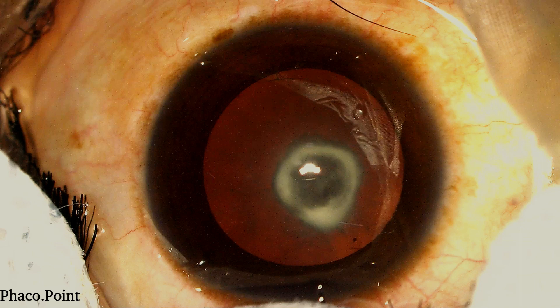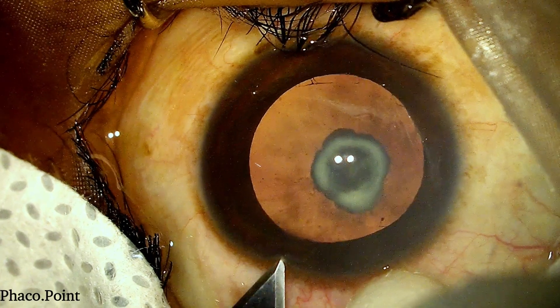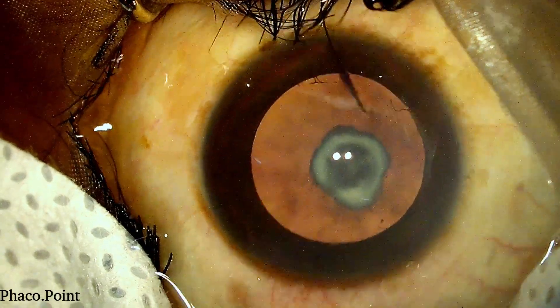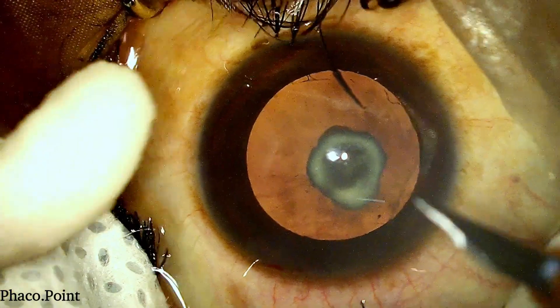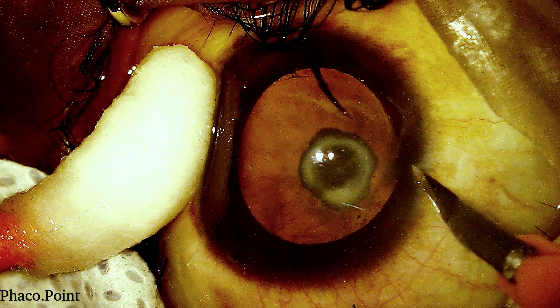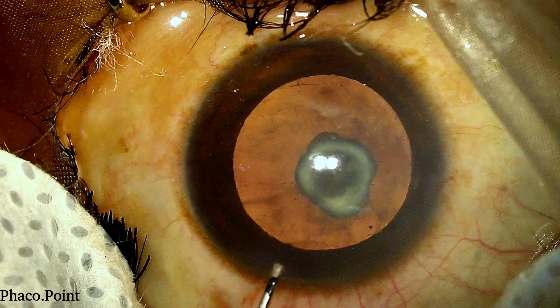This is the patient with a classic posterior polar cataract. After installing a few drops of paracaine prior to this step, we start with making the incisions as well as creating both the paracentesis incisions. We must always have counter pressure while making these incisions. Note how the cotton bud held at the opposite point gives me the counter pressure. We then inject some intraocular xylecaine to give some intraocular anaesthesia.